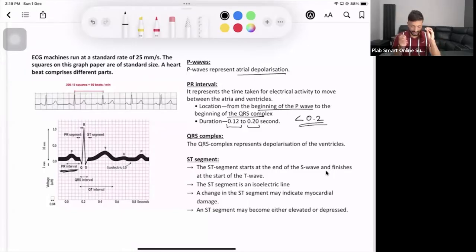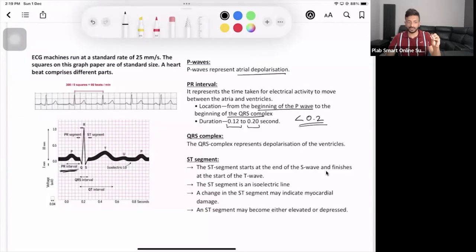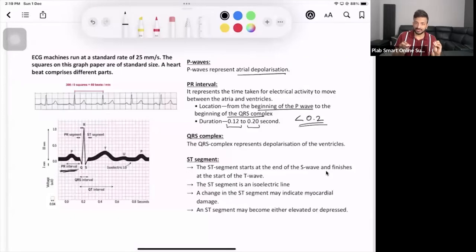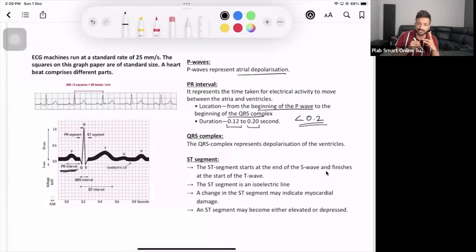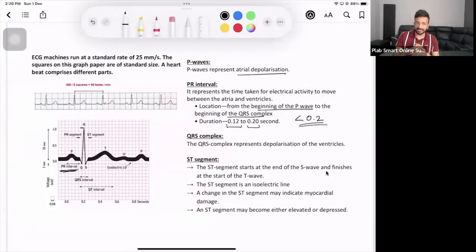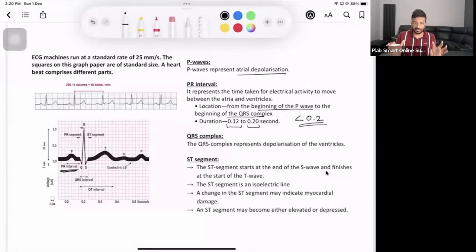The QRS complex represents ventricular contraction. The T wave represents ventricular repolarization — ventricular relaxation. A good question is: where is the wave for atrial relaxation? The atrial relaxation wave is not visible because it is hidden within the QRS complex itself. So: P wave = atrial contraction, QRS = ventricular contraction, T wave = ventricular relaxation.